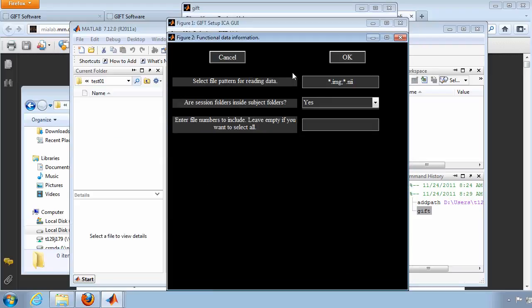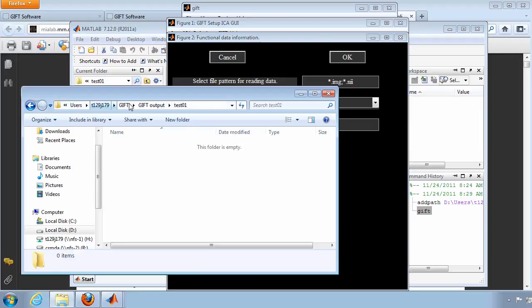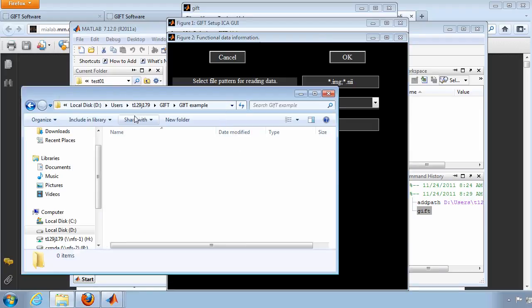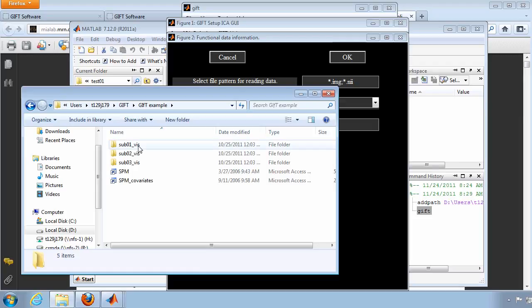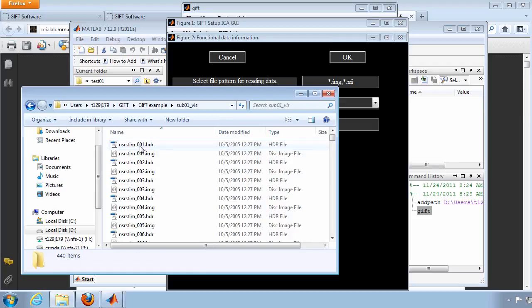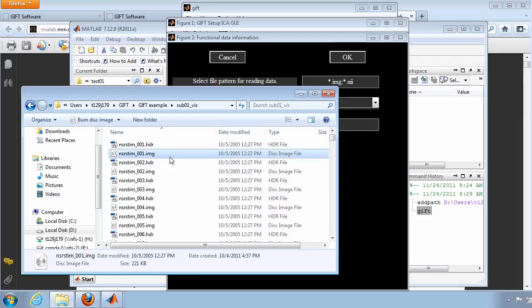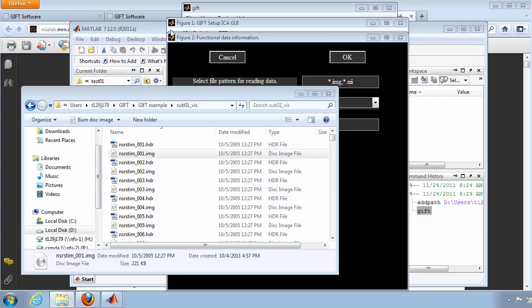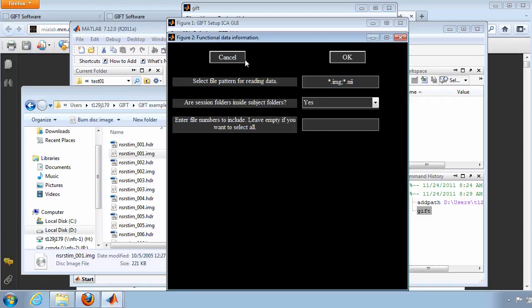Data for all subjects will be analyzed at once, so you can store each subject's subfolder in the same folder. All data should be pre-processed prior to analysis using ICA. In the next window, notice that the program will accept multiple kinds of image files in the same analysis. All our example data is .img, so you can keep the default.